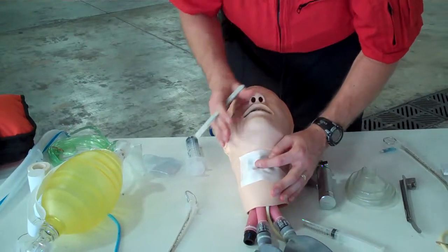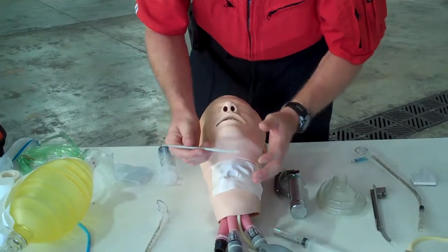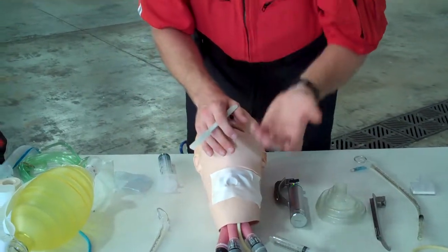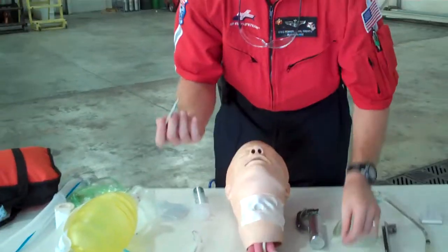I typically like to be at the patient's head when I'm managing it. I would have suction on hand. I would have my partner with me, and this is an emergency situation. If I could provide the patient with analgesic therapy, I would. Often in these situations, there's no time. So we're going to take the scalpel.